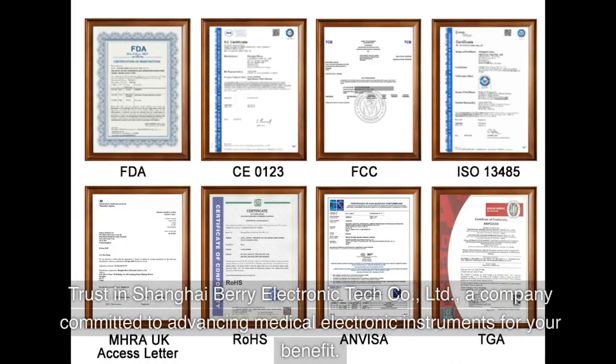Trust in Shanghai Berry Electronic Tech Company Limited — a company committed to advancing medical electronic instruments for your benefit.